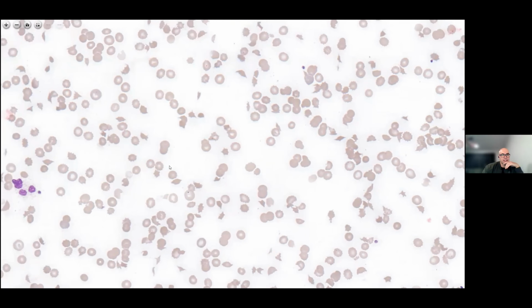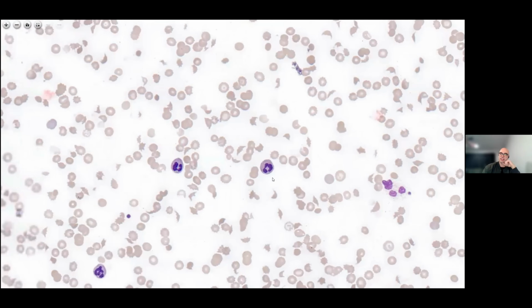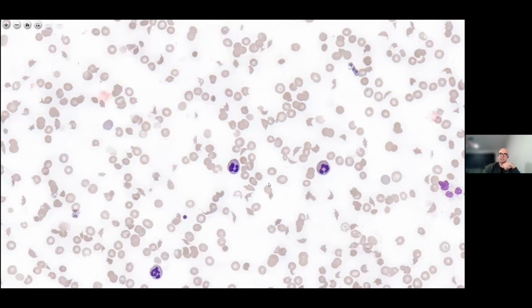and I think where I was looking before was too thick in the blood film, where you start seeing this pseudo rouleau formation. Rouleau formation is when, think of it as cells sticking together end to end, looking like a pile of coins that has been tipped over on a desk, or poker chips that have just been knocked over and form a stack, or like Oreo biscuits laid out on a serving platter.